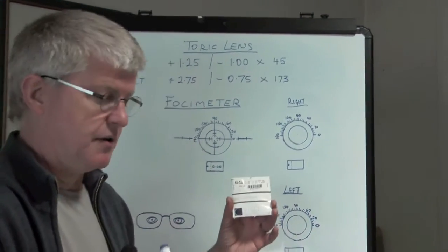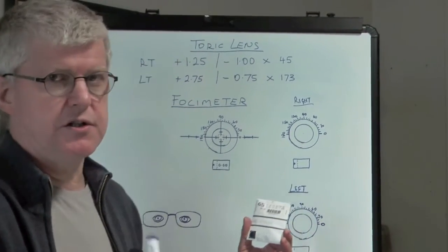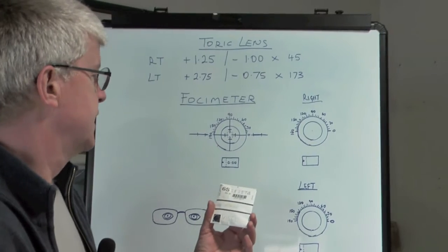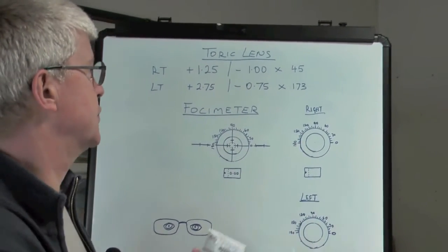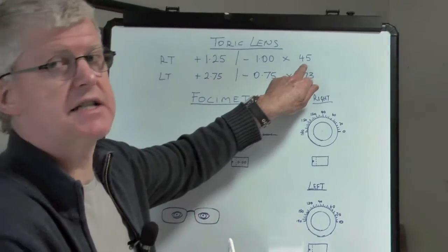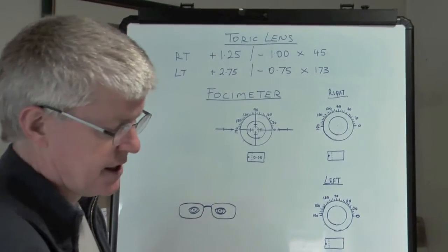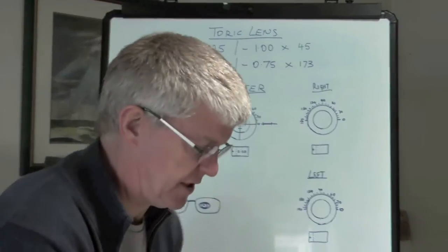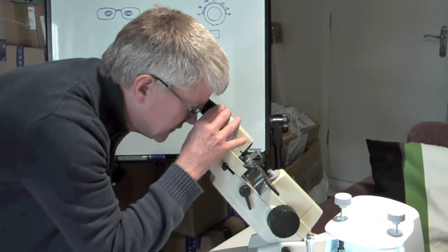I want to show you how to use the focimeter. The best way to do it, if you're not familiar with this, is to do it in a systematic way. What I would do is first of all set the axis, which is 45. This dial here adjusts the axis, so you set the axis at 45 degrees.